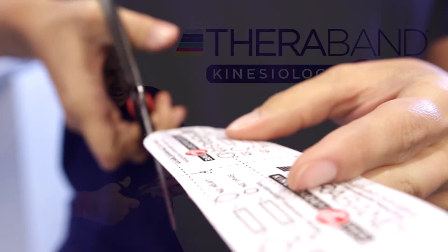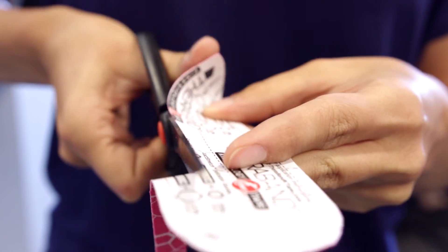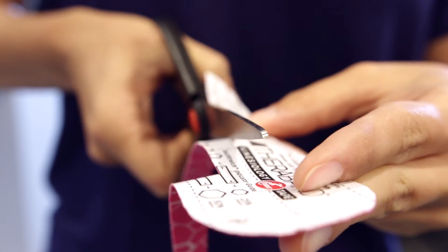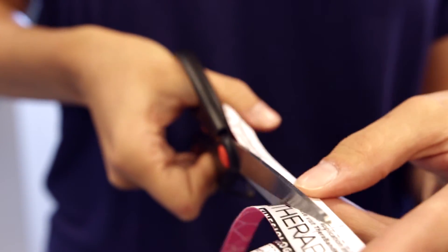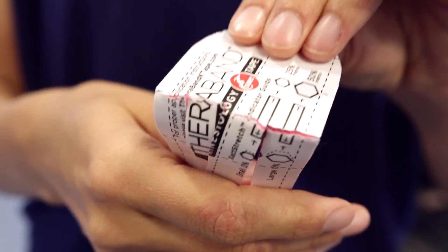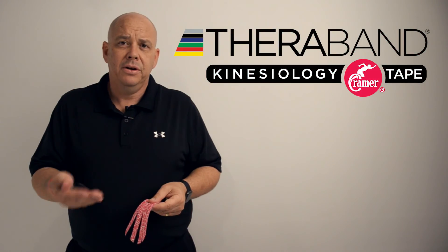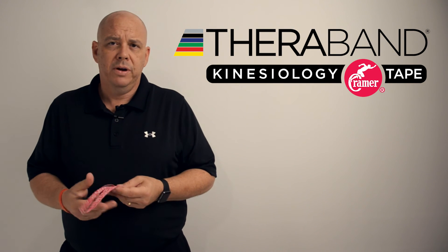You can cut anywhere from four to six of these fan strips. I'll break the paper backing from both anchors and apply them directly to the skin. Each strip gets a specific amount of tension, and as I mentioned, with a circulatory application I'll generally use less than 25% tension.